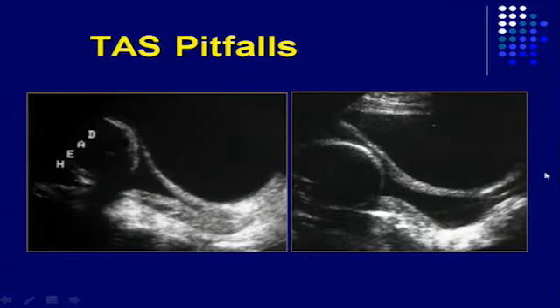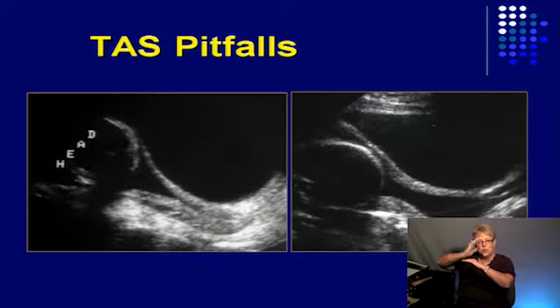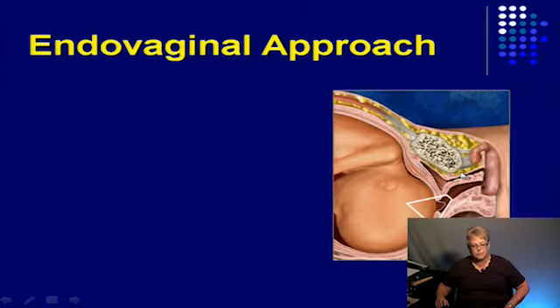And this full bladder did not help us. So you can see how much fuller it was here. We had her go empty her bladder. She still had fluid in there when she came back, but look now. So you can falsely compress that anterior wall together, making it look like a previa, or you can compress the cervix down, making it look like the cervix is closed when it's not. So do yourself a favor, don't fill the bladder up anymore.